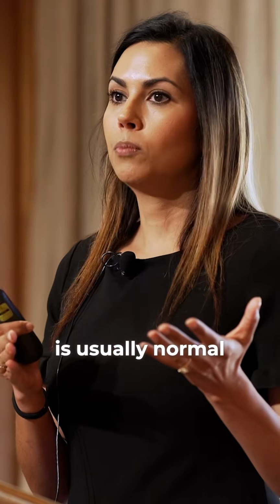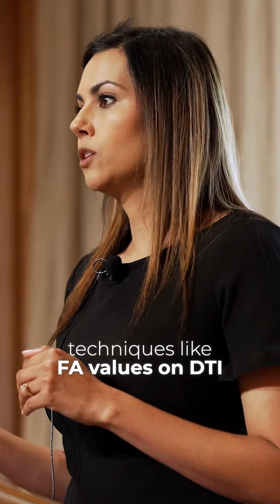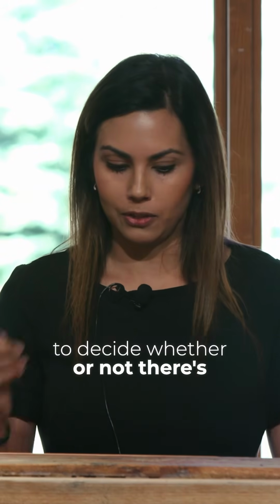Conventional imaging is usually normal for mild traumatic brain injury. Maybe you see some hemorrhage, but it's usually completely normal. And then with our advanced techniques, like FA values on DTI, you can actually look at the microstructure of part of the brain to decide whether or not there's any integrity loss.